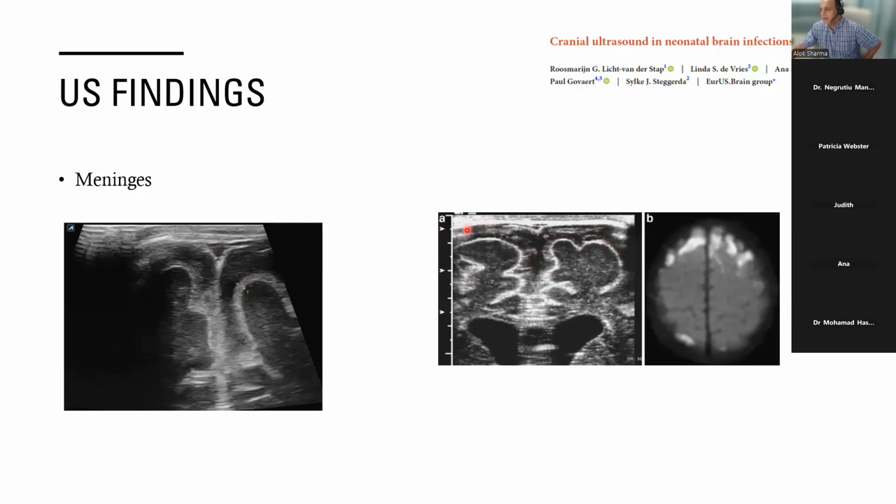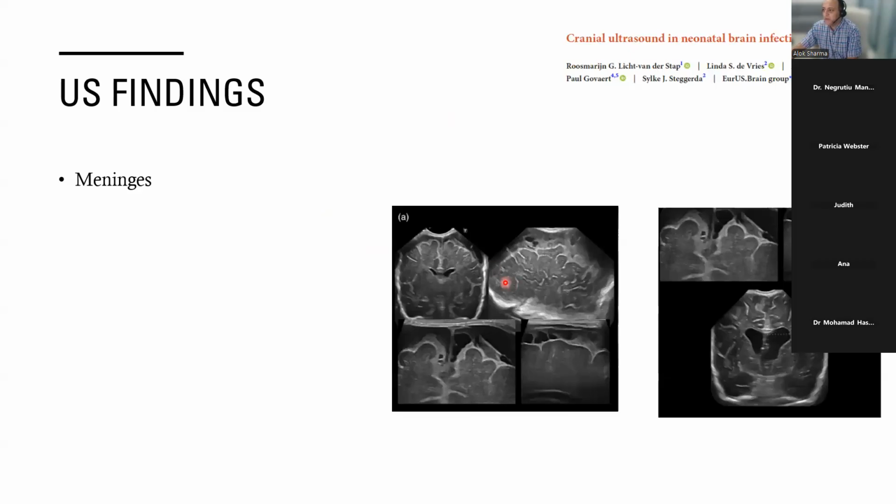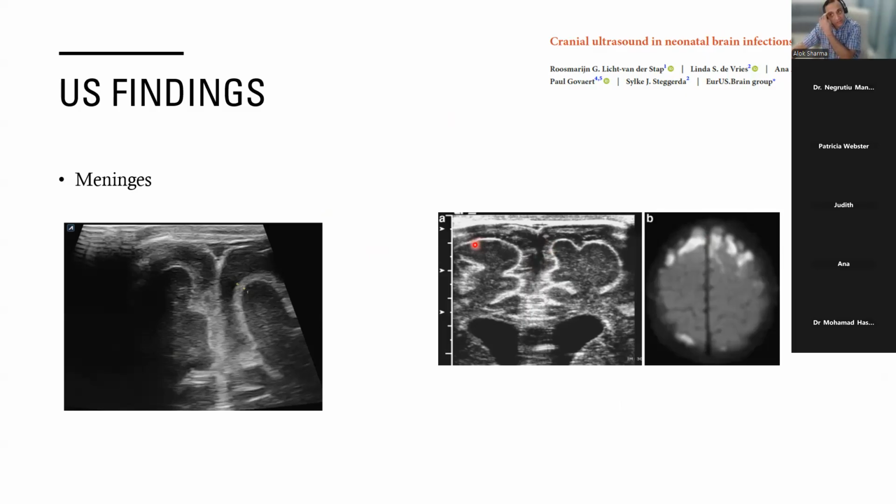And if you read the article, they actually tell you what organism the baby's actually got. But again, very, very highlighted kind of sulci and gyri look very bright, again, with increase in extra-axial space with actually exudate visible in them. These are both with the linear scan. So really, experience says that you're probably going to do this scan first. And really, if you have a high index of suspicion, then default to the linear scan.